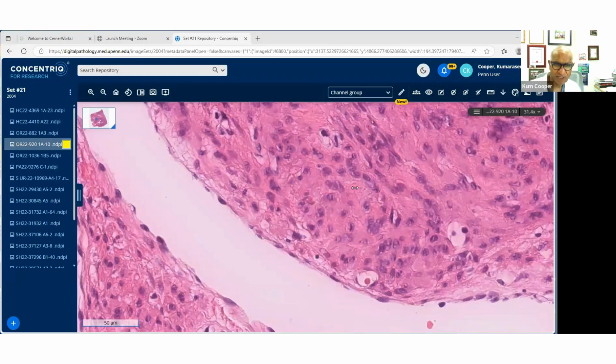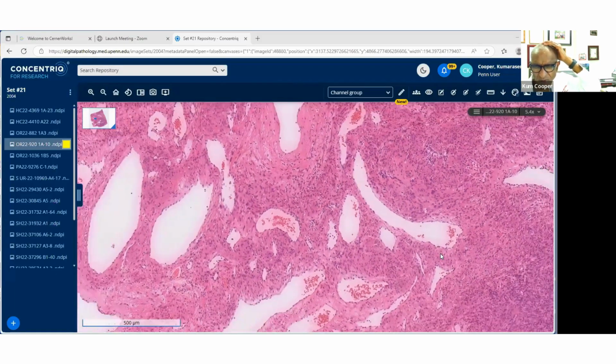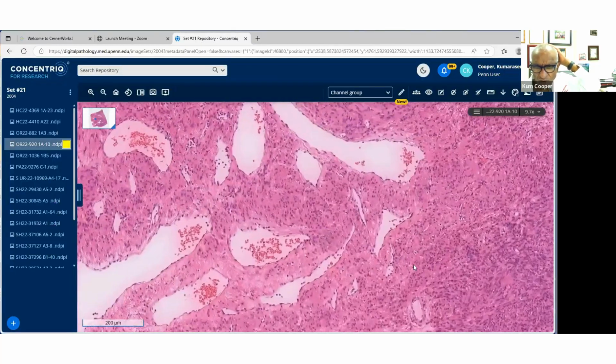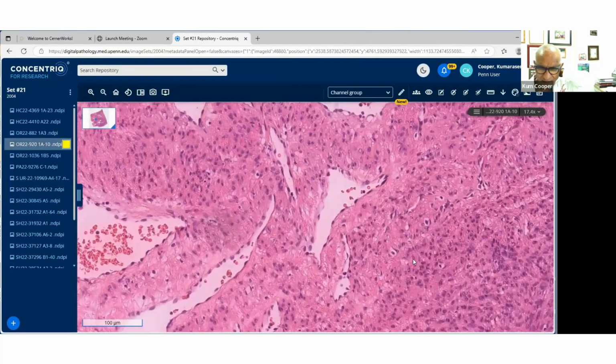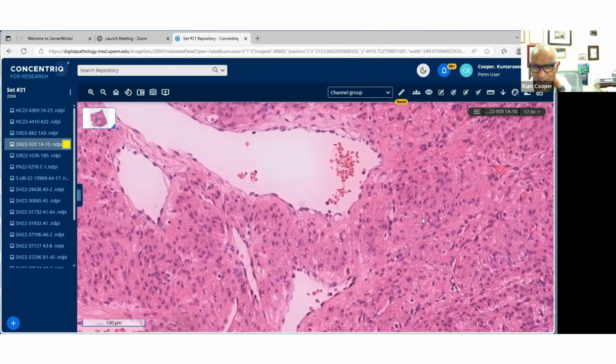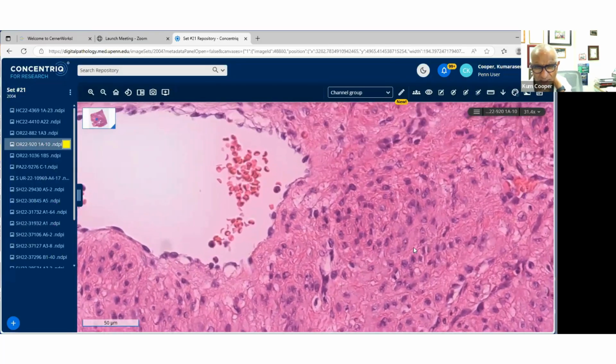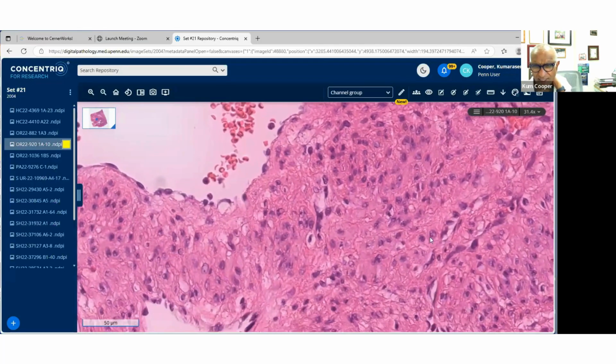I'm just looking to see where did I see, yeah, here we go. Endometrial stromal sarcomas, typically the low grade, are CD10 positive, and of course you can always resort to FISH for SUZ12 and JAZF1 and PHF1 very rarely, but those can occur. Here, there's some epithelioid cells as well, hopefully coming through quite nicely.